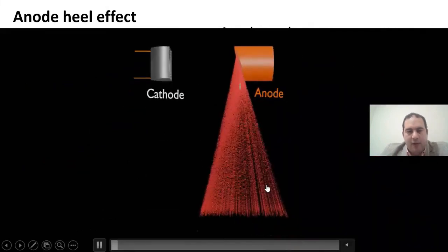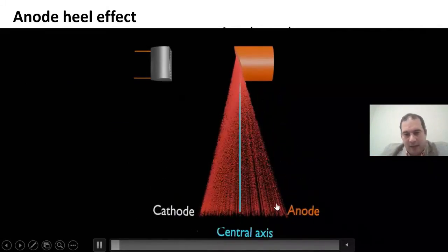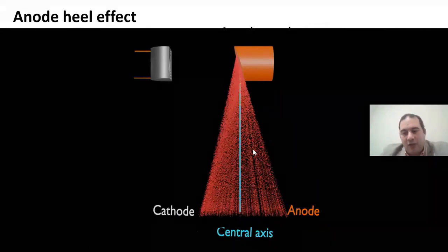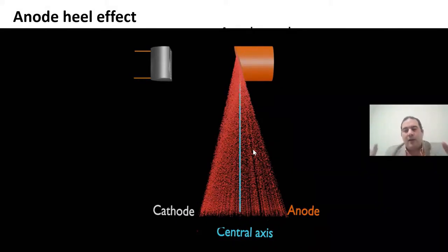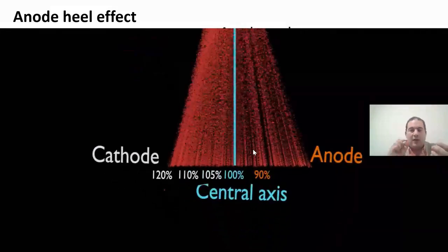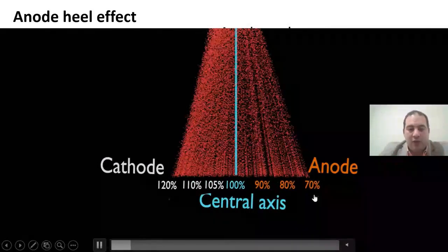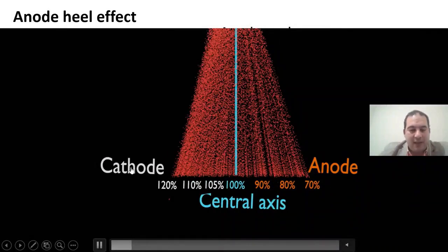This is the X-ray beam coming from the anode, and this is the central axis for me. This is the direction of the cathode, and this is the direction of the anode, as we mentioned. As the doctor pointed out, there is a part that comes down here from the anode material itself, causing attenuation. The intensity, as we discussed in the last lecture, does not refer to the number. We are talking about the summation of the energy of all the photons present. This part was a bit confusing, because one might say it does not refer to the number, but it's as if you take the count and multiply it by the energy of each photon and sum it all up. That is the meaning of intensity.